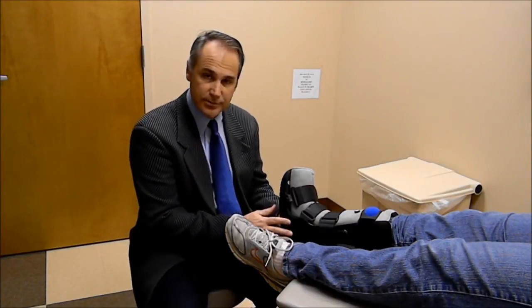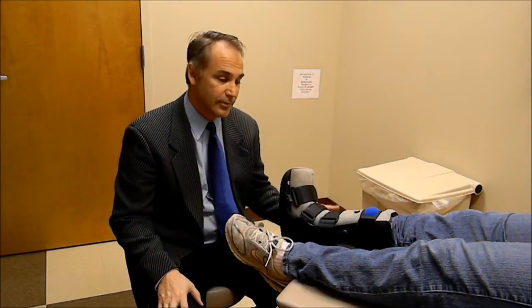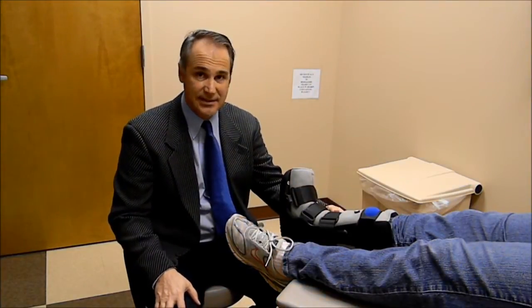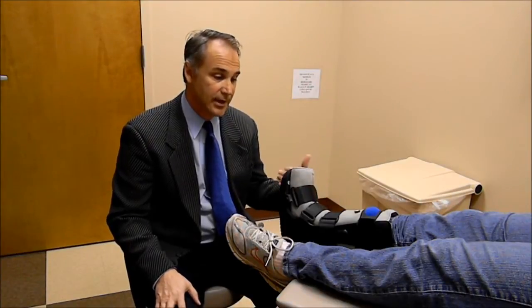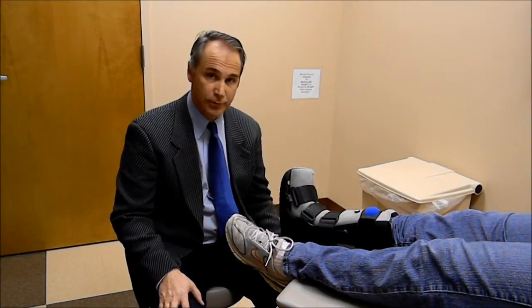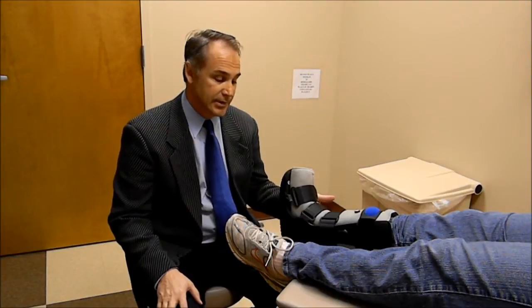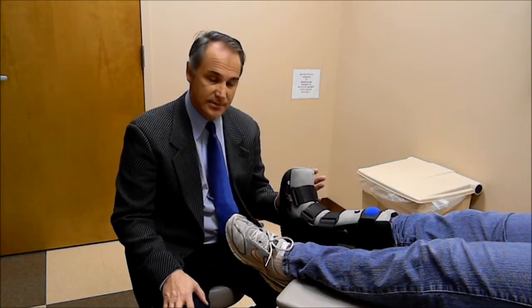The problem with fracture boots — and they are great devices — is that they've helped us quite a bit with a decrease in the amount of casting we had to do. Prior to this, we had to put patients in a cast. It was messy, time-consuming, and difficult for the patient. They couldn't take it off until you removed it for them. With these, patients can remove them, they can shower, they can do some range of motion exercises. They're great devices.